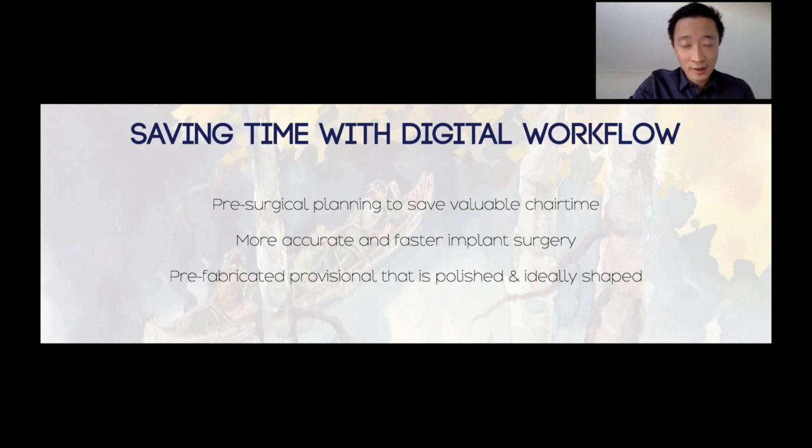Okay, so I'll conclude with just a few points here about saving time with digital workflow. As you can see between the two cases, for case number 1, there's not as much pre-surgical planning. I mentioned we took a CBCT and that's really all we had. But with case number 2, there is some more pre-surgical planning, but it saves valuable chair time. So it's the difference between spending time with the patient in the chair versus not.